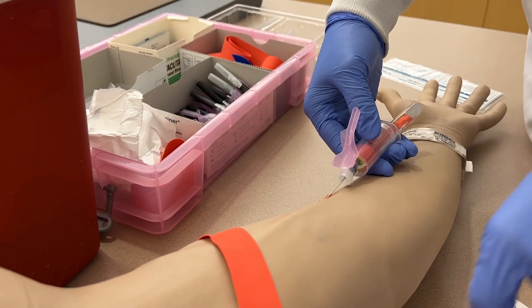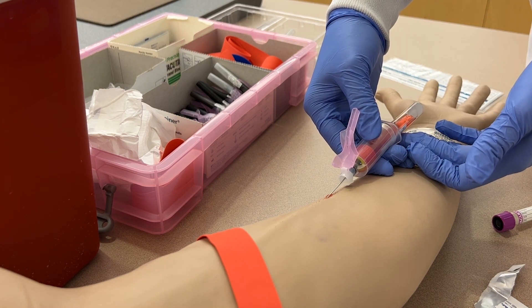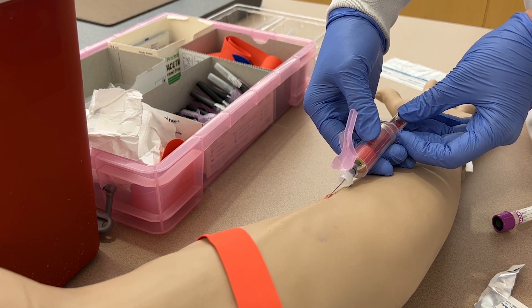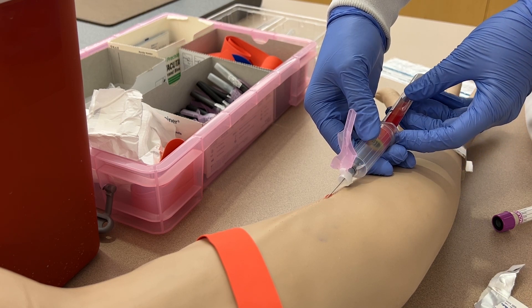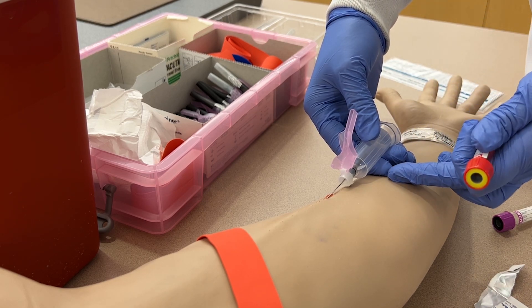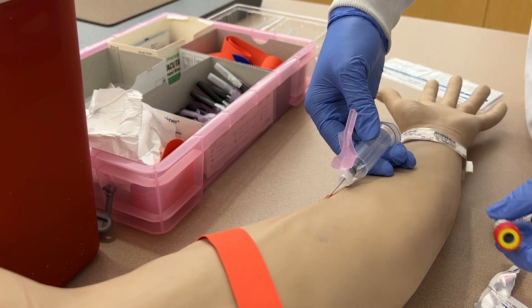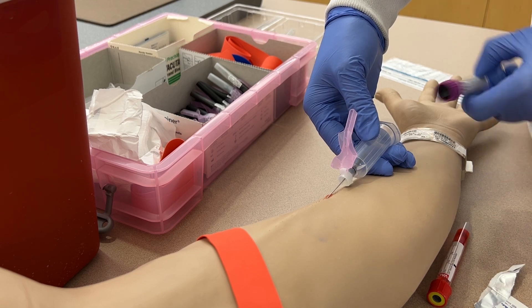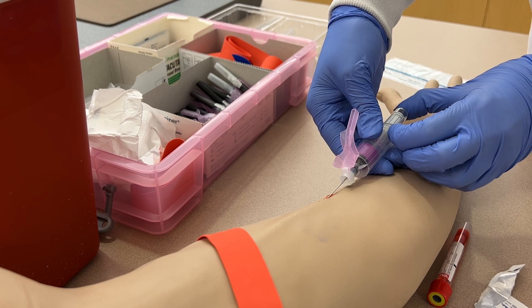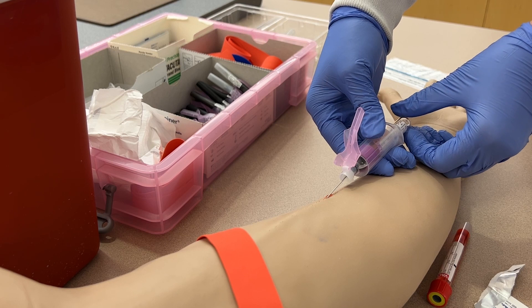At this point you can release the tourniquet. Once the tube has filled, use your middle finger under the tube and your thumb on top, then use your index finger against the ledge of the tube holder to push against it and pop the tube off, then gently invert the tube. Keep in mind your finger should be resting on the patient's forearm to keep the needle steady. Then grab your next tube, put your thumb under the bottom and index finger on the tube holder ledge, push it on by pinching your fingers together, and spin the label around so you can see the blood fill.